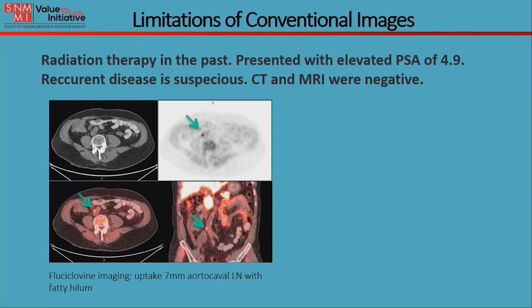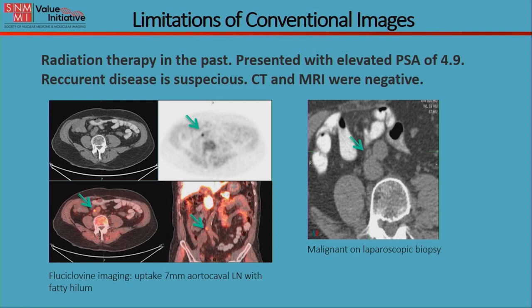Let me emphasize what I am trying to say here. This is how a fluciclovin PET-CT will look like. This is a patient where, if you look carefully at the CT image — that is the conventional image — you can see in the green area there is a reverse U shape with a center dark line inside. That is in fact a normal-appearing lymph node. It's not abnormal by location, not by size, and not by morphology. Yet when we did the fluciclovin imaging using that amino acid, on the left side we see — on the white and black images, it looks like a black dot; on the orange images, it looks like an orange dot. We can actually see that the tracer showed abnormal concentration, pointing out that there may be cancer in that cell.